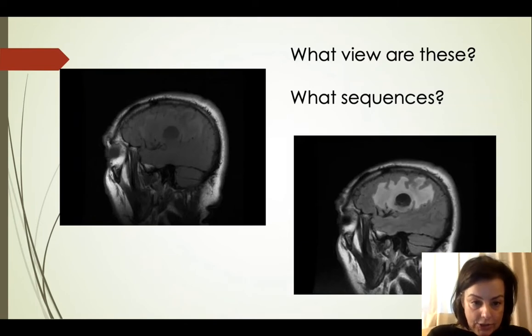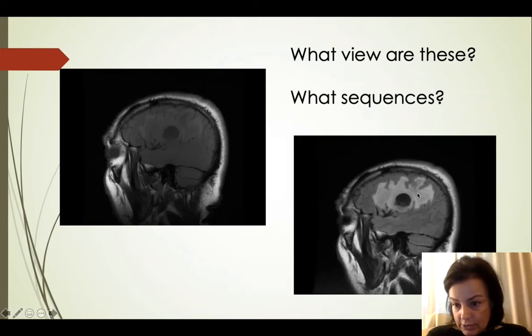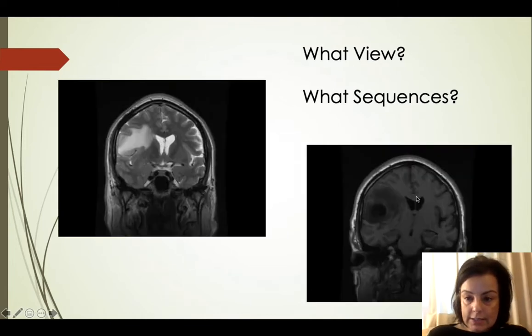So these are sagittal images, as you know, and you can really see all of that edema. And a coronal view, again.